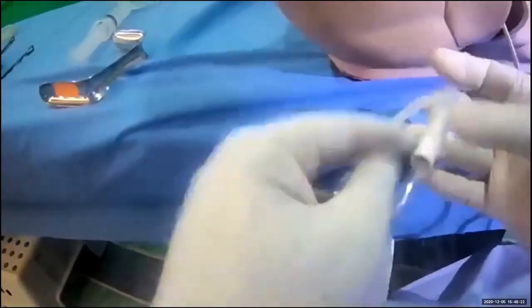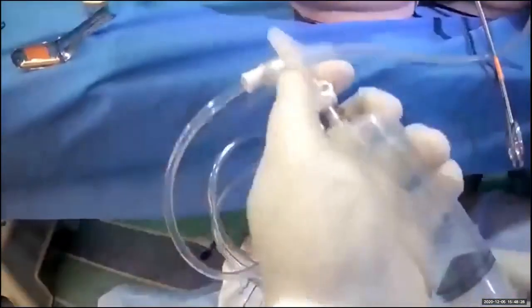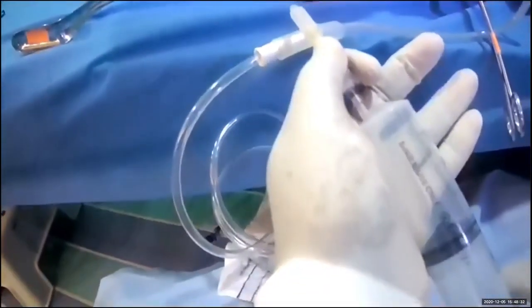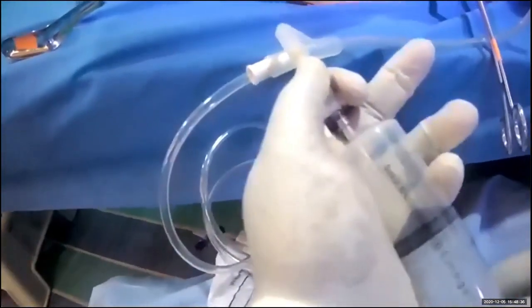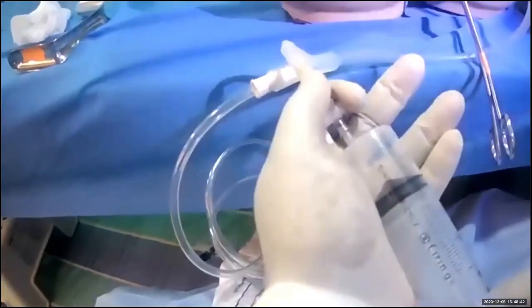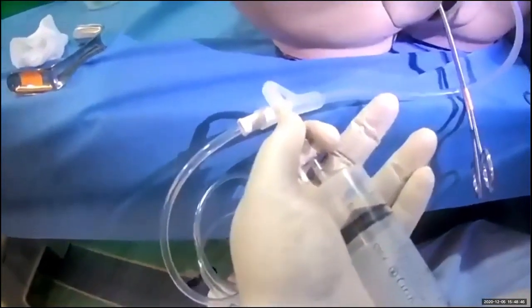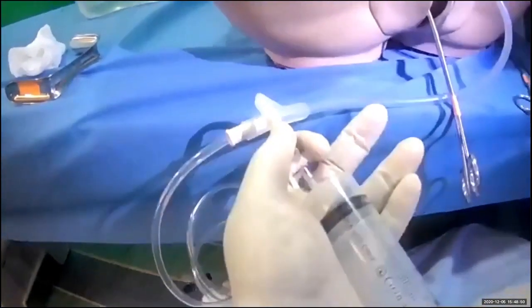Then you need to inflate the balloon. A commonly asked question is: how much fluid do you inflate? You inflate 50 cc first, then continue to inflate until the bleeding stops. The maximum fluid you can infuse is 500 mls, but you don't have to reach 500 — you can stop once the bleeding stops.